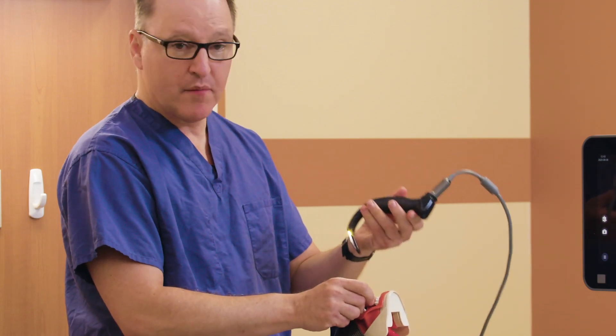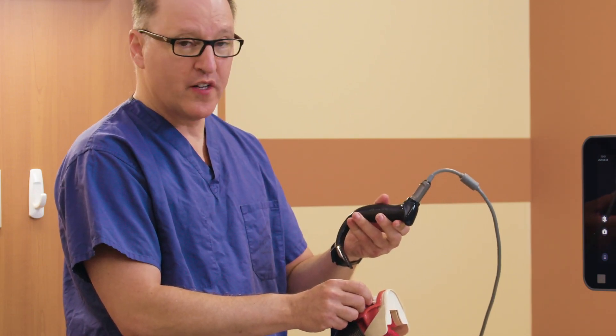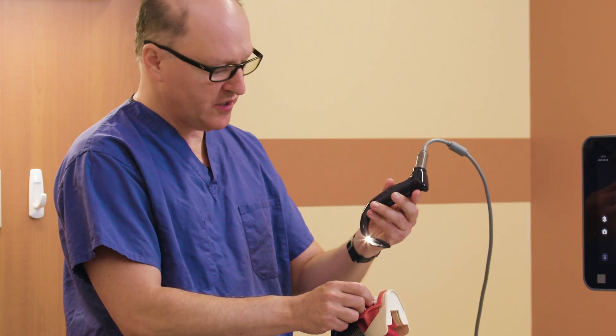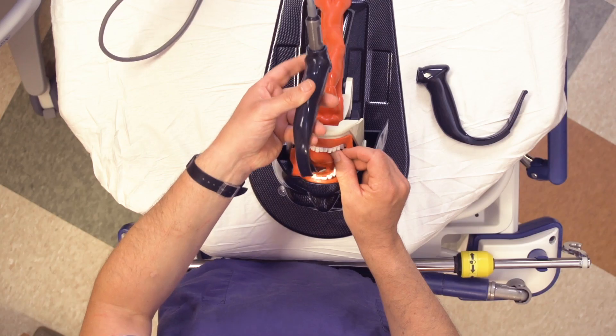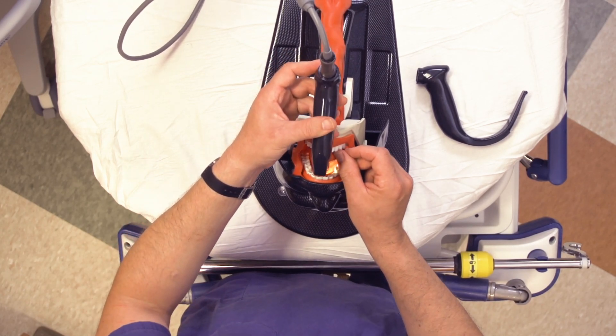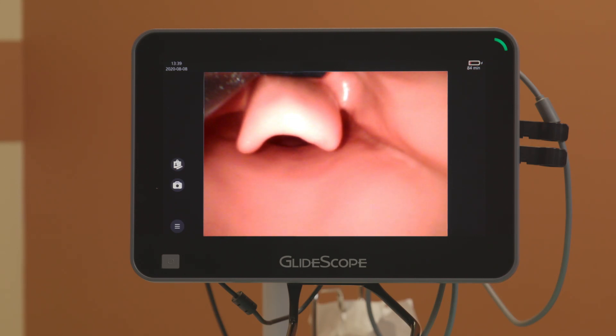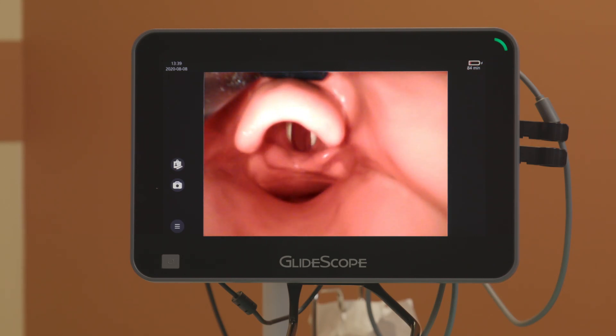I just want to compare in this mannequin the two different views afforded by a three, which I believe works for most adults, and the four. As we rotate around following the curvature of the blade, I can see the uvula under direct and then I rotate down. I have seated the tip of the blade in the vallecula. Now I get a view of the target like so. I am leaving the lower half of the screen free for tube delivery and my view is about 50% of the larynx. This is ideal for tube delivery.